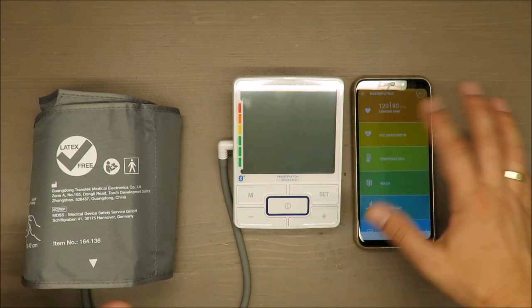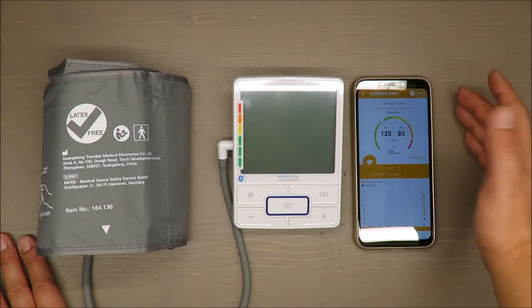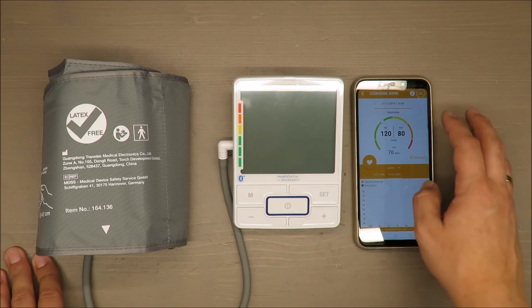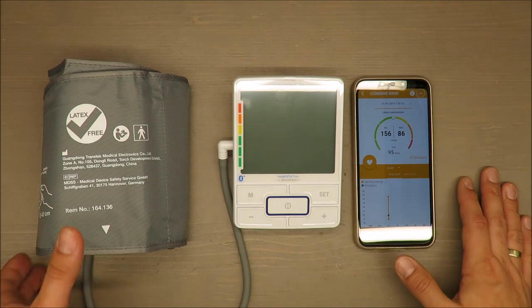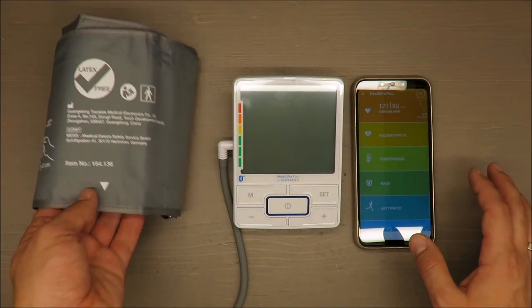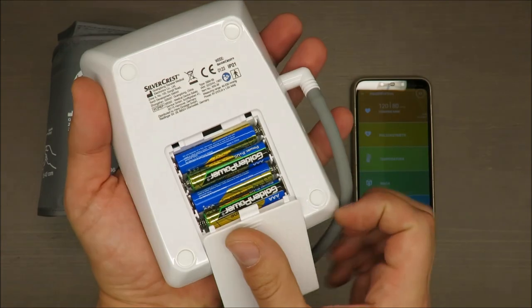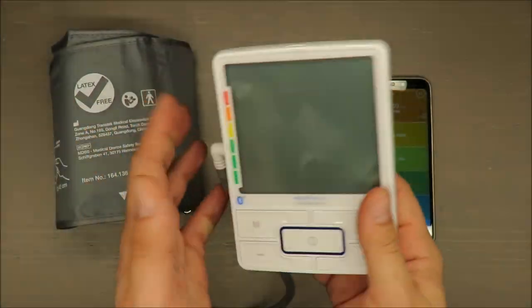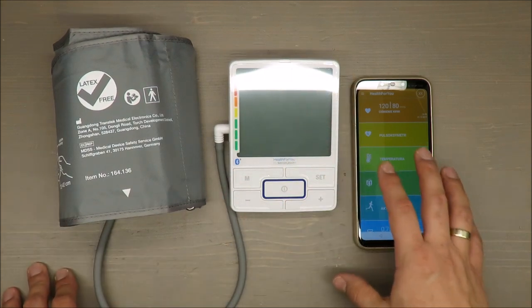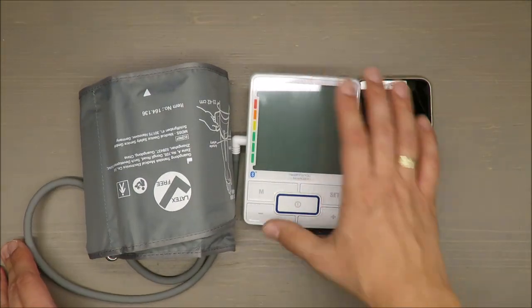So after some big struggle at the beginning, the application is actually really responsive. I think it's quite useful because you don't need to remember what your result was, and it seems to work quite automatically. Only one thing, not about this device, but the stock batteries are quite low quality, so I highly recommend you fit this device with rechargeable ones, because I can hear that it's almost managing to work. I think those batteries will die quite soon.